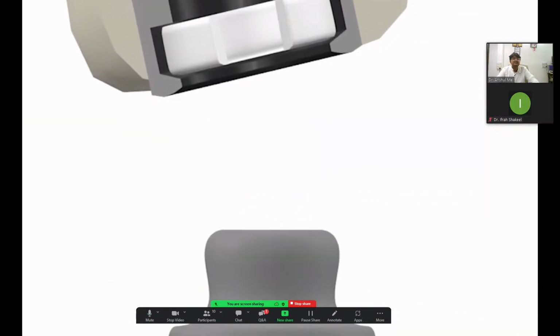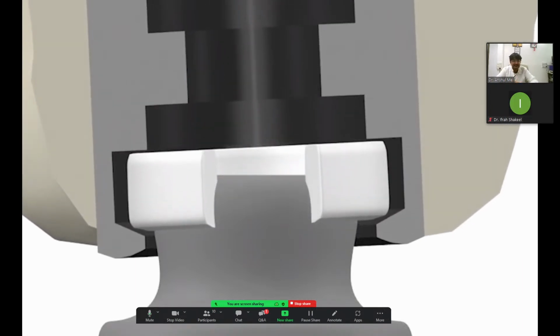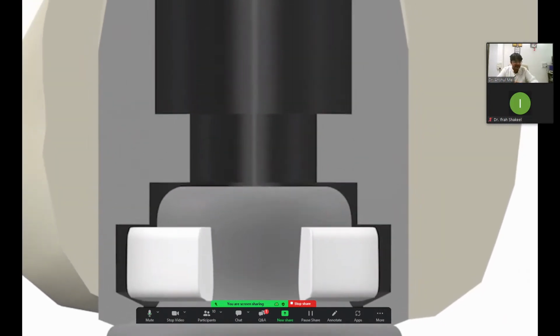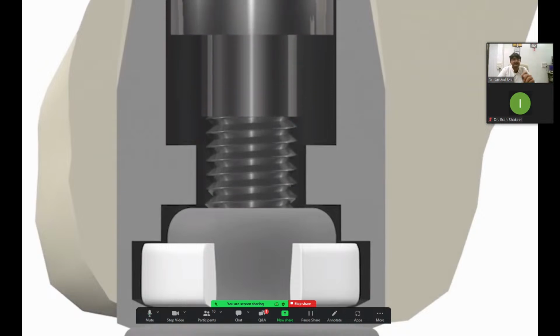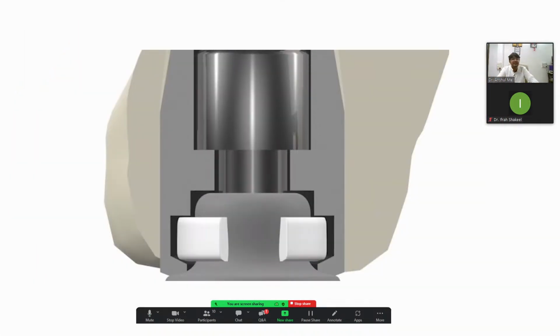And along with that, this is an abutment called OT Equator. It has a cylinder like an overdenture, like the ring and the screw. So it has the advantages of an overdenture as well as a fixed prosthetic. The overdenture will give you stress breaking as well as a fixed solution. If you are looking for that, then the OT Equator is the better solution.